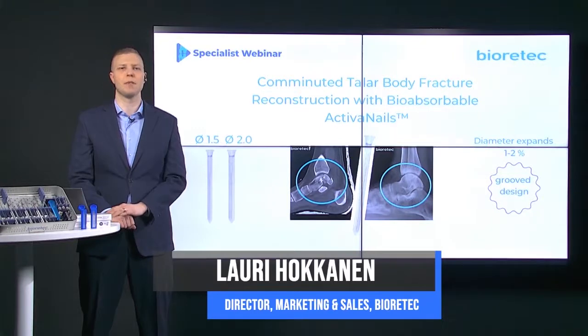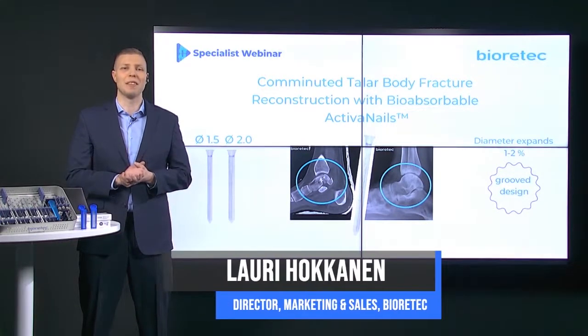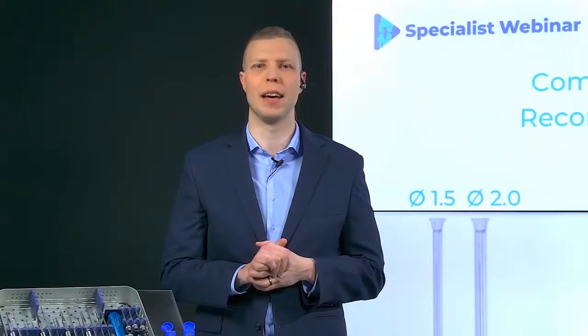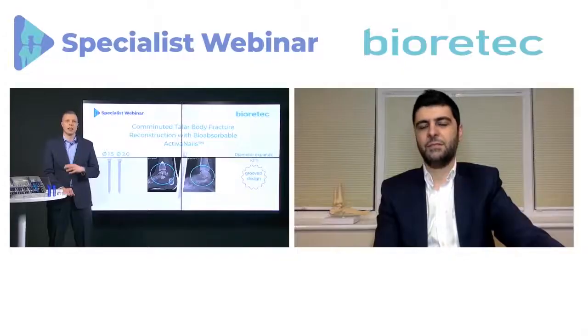In today's specialist webinar, we focus on talar fractures, comminuted talar body fractures. The implant that we are focusing on now is ActivaNail, similar to ActivaPin, but with the conical nail head. It gives a little bit more pressure to the area. Our guest speaker today comes from London, UK, Mr. Ziad Harb. He has done cases with this technique, with this very difficult indication.